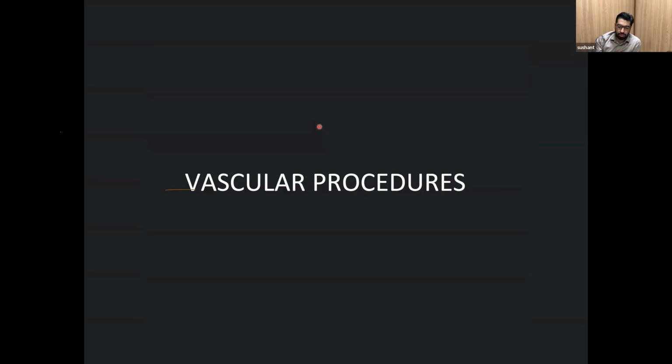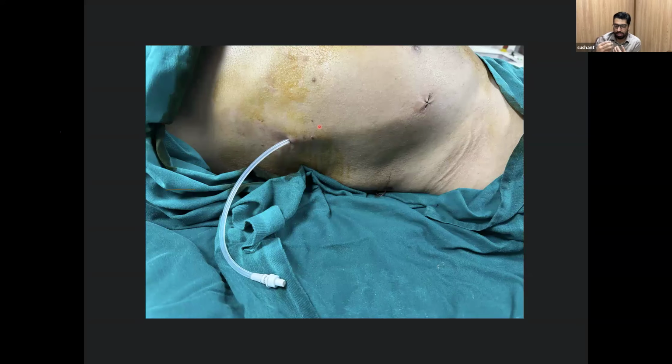So basically, the non-vascular procedures, be it the PCN, PTBDs, liver abscess drainages, or pancreatic drainages, use multiple catheters that come in various sizes. These sizes can be used according to our requirement. If we have to drain pus or very large thick collections, we can go for a 16 French, 20 French, 30 French, or a larger high bore catheter.